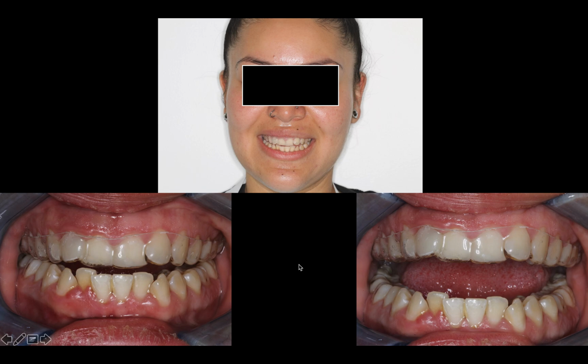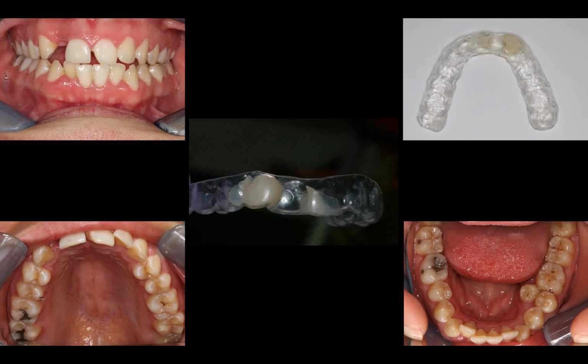Patient loved it. I think if I would have had a little bit more time, I could have delivered a little bit more of an aesthetic Essex retainer. But nonetheless, patient was happy with it, and that's what we went with. And I think she wore that pretty well, actually. She wore this Essex for about 5 months before she initiated orthodontic treatment.